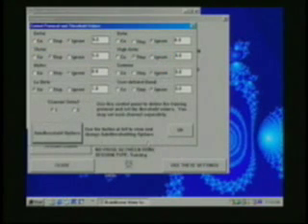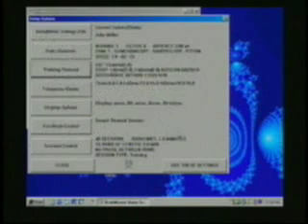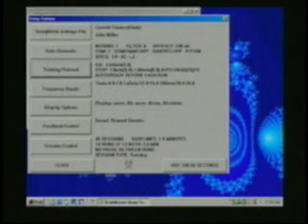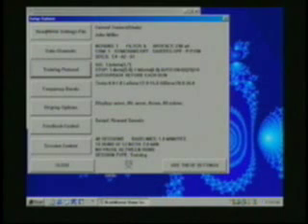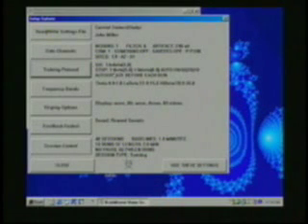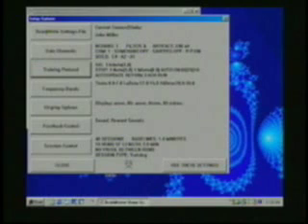We now press OK. And then OK on the protocol box. And we see now in review, the go is on low beta with a threshold of one. Stop is on channel one theta, threshold of five. And a stop on high beta with a threshold of eight.